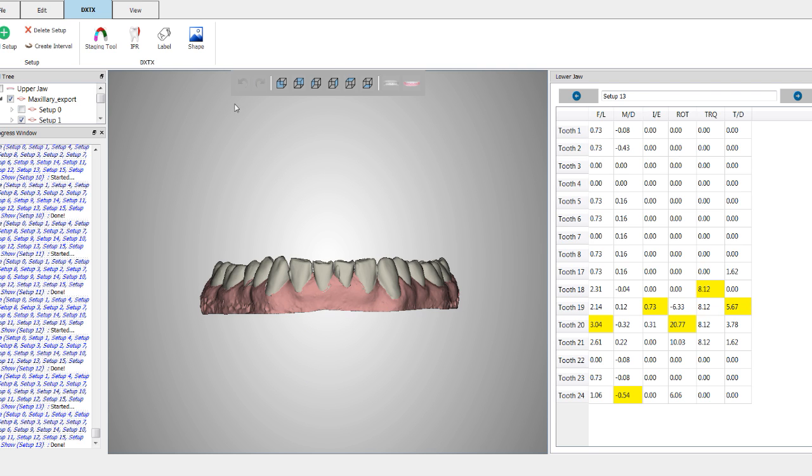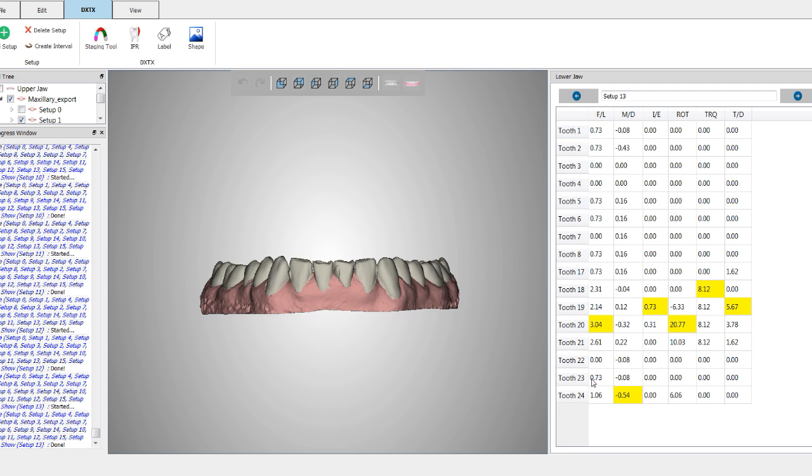All right, so how do you use the shape tool? Very simple. Well, first is you're going to look at the table over here and decide which teeth need to have attachments.